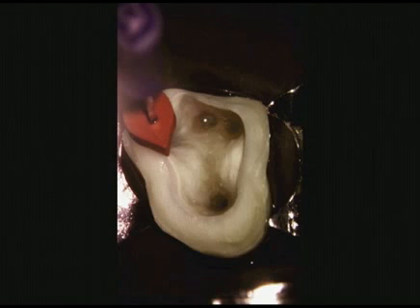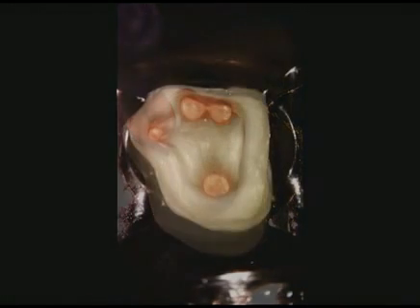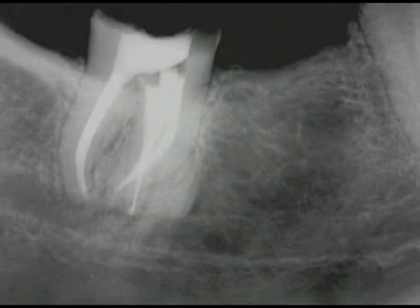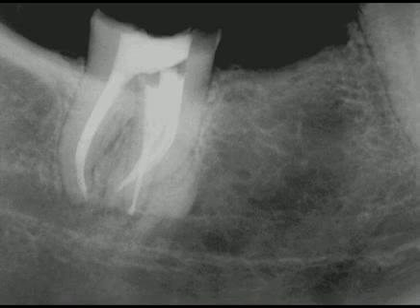This paves the way for the Pro Ultra Endo 1 using the 10-minute rule. Following post removal, cement is removed from the mesiolingual aspect of the pulpal floor, a displaced extra orifice is identified, and the canal negotiated. We can observe the pulpal floor following 3-dimensional cleaning, shaping, and obturation procedures. A post-operative radiograph confirms the disassembly efforts, the smooth flowing shapes, and the packed systems.